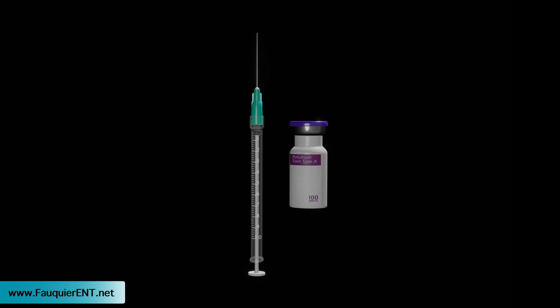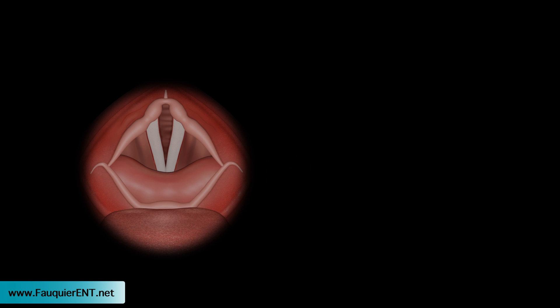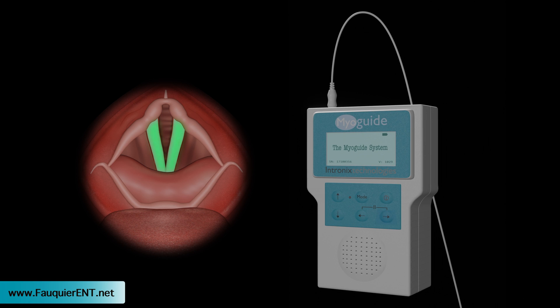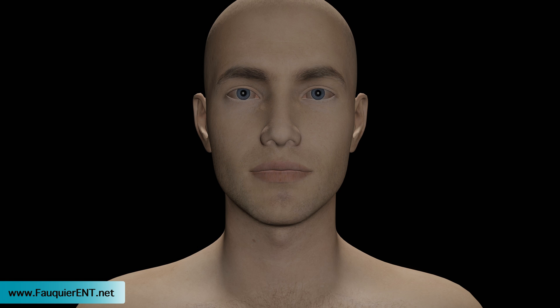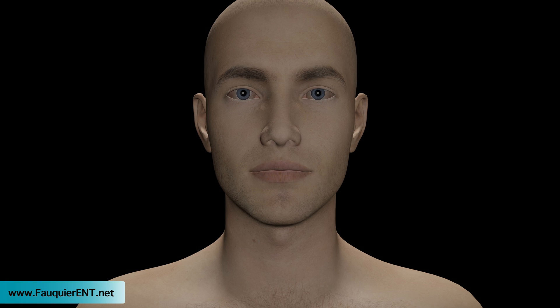The standard treatment for adductor spasmodic dysphonia is botulinum toxin injection into the thyroarytenoid muscle under EMG guidance. Although positioning and steps may vary between healthcare providers, the basic steps in performing EMG-guided botulinum toxin injection to the vocal cords are as follows.